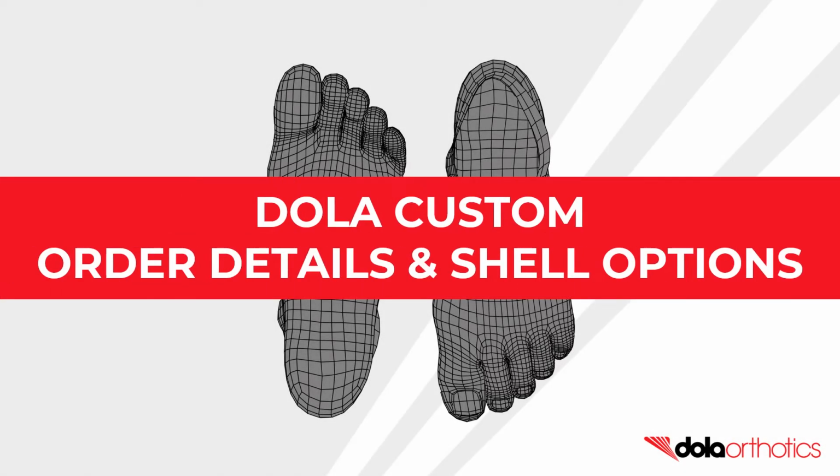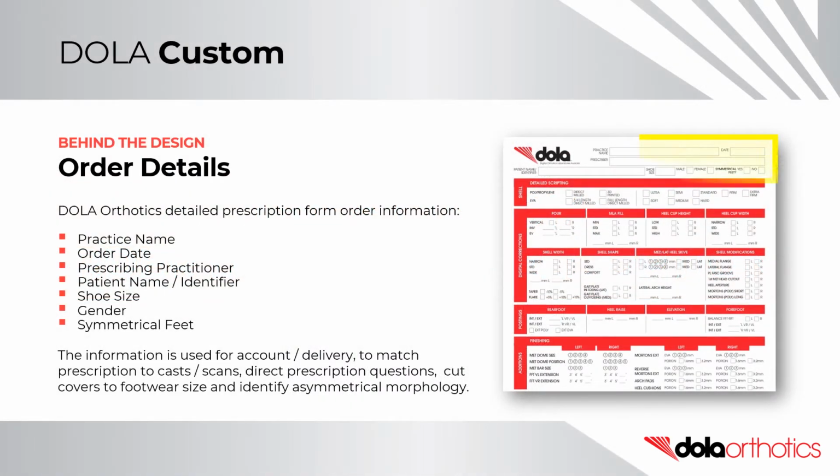DOLA Custom Prescription Education, Order Details and Shell Options. Behind the design. Order Details.